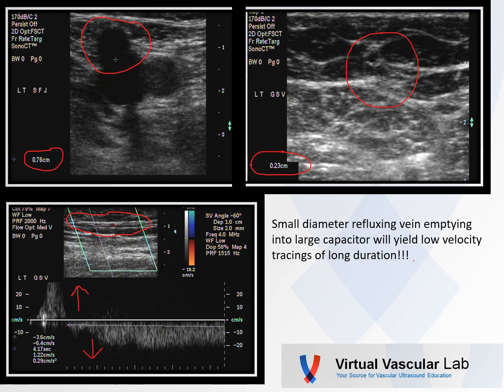What about a small diameter vein emptying into really large varicosities? Here's an example: at the SFJ on the left her vein was 7.6 millimeters — not terribly small but not terribly large. However, as I moved into her thigh her vein became very small, only 2.3 millimeters. Much to my surprise, when I assessed her for reflux — obviously in the standing position because of hydrostatic pressure — she had a tremendous amount of reflux: a very low velocity tracing around 20, but a very long duration. The next clip will be a video of that tracing.